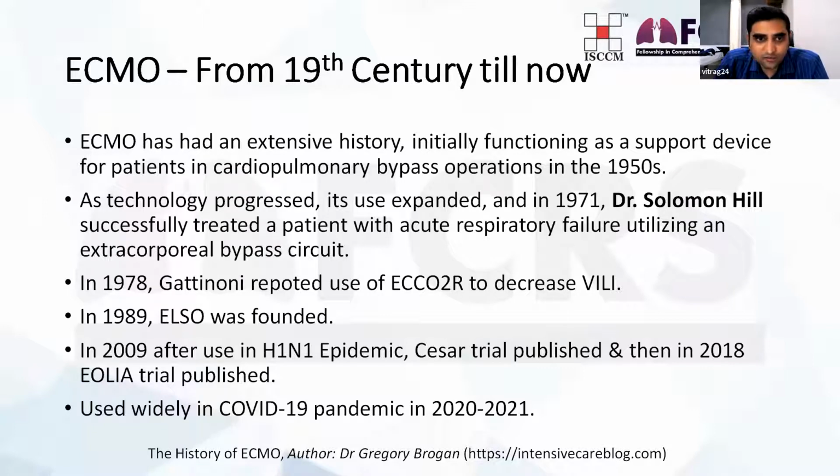Initially, it functioned as a support device for patients in cardiopulmonary bypass in 1950. But as technology progressed, Dr. Solomon in 1971 successfully treated a patient with acute respiratory failure with an extracorporeal bypass circuit. So this was the first case of ECMO outside cardiopulmonary bypass. Thereafter, in 1978, Gattinoni reported use of extracorporeal CO2 removal to decrease ventilator-induced lung injury. Then in 1989, the Extracorporeal Life Support Organization was founded.